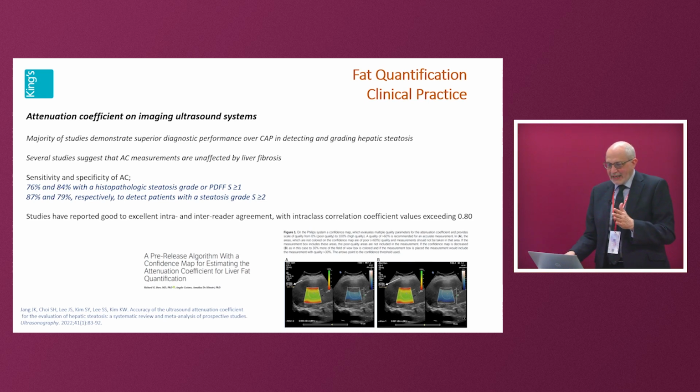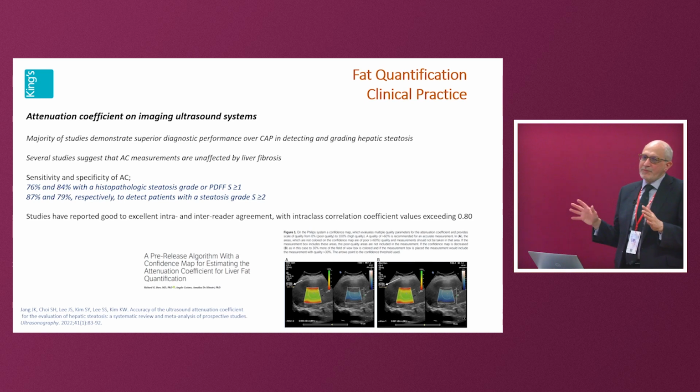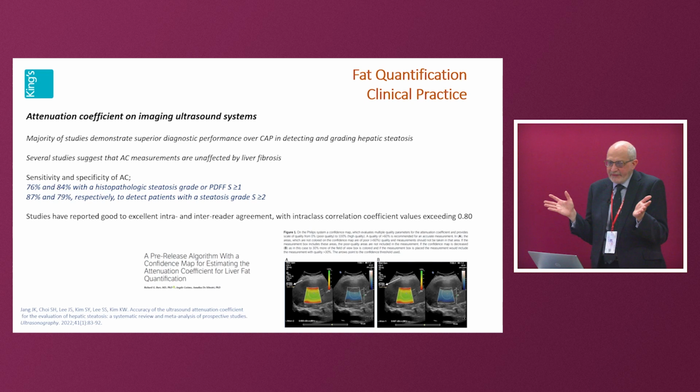And the limitations, if you use this, and most of the machines that you're going to use are attenuation, are that there are no specific cutoff values. So when you're using it, you don't know what you're cutting it off for, at what level. You just don't know yet. And different studies, different machines show differences. And there's no consensus of box.